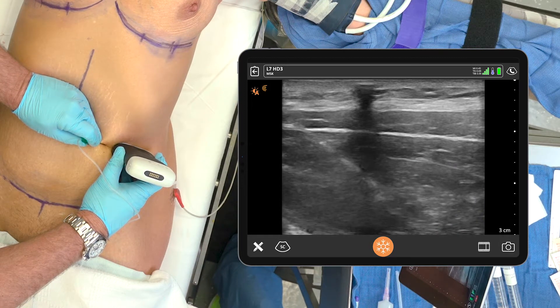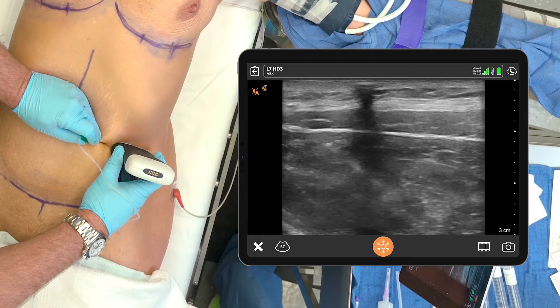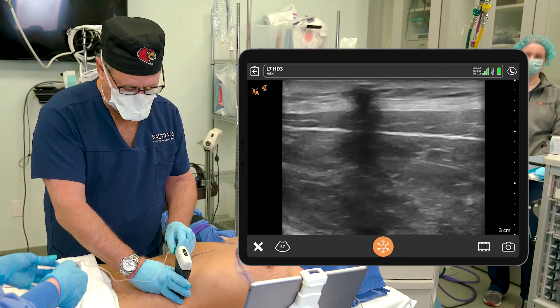It's going in easy. We put 15 cc's of that on each side. Okay, that's one side done.